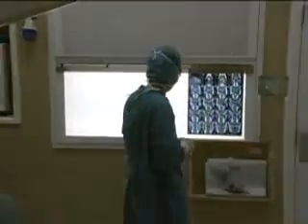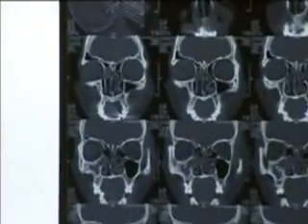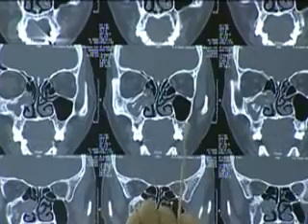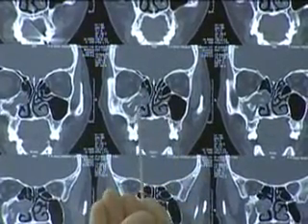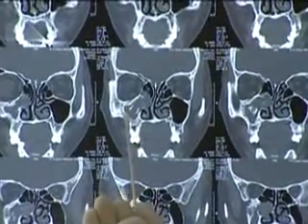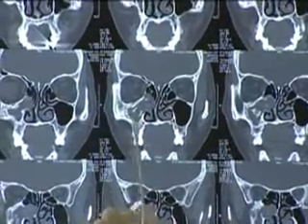Okay. Can I have a pointer? So now I think we have removed the main bulk of the fungal sinus disease here. The maxillary sinus is not as big as the opposite side, as you can see here. You have a very good pneumatized maxillary sinus, but on the other side, there's a lot of sclerotic bone here. Actually, the volume of the sinus is just like that. What we see through the inferior meatal antrostomy is as big as that.